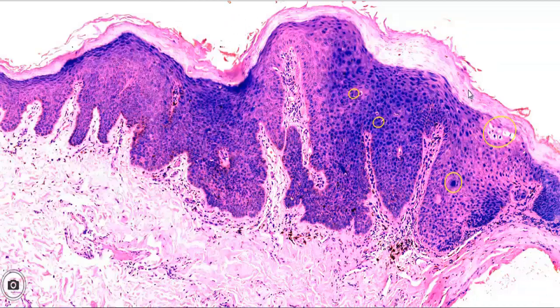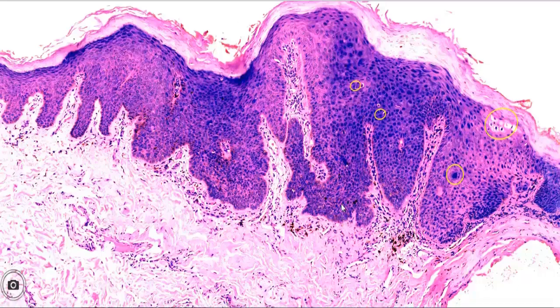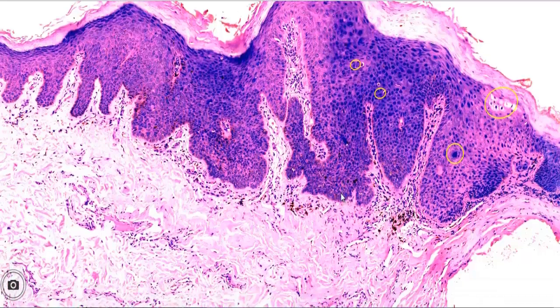Microscopically, the vulval biopsy at lowest magnification shows irregular acanthosis of the epithelium and marked cellular abnormalities.